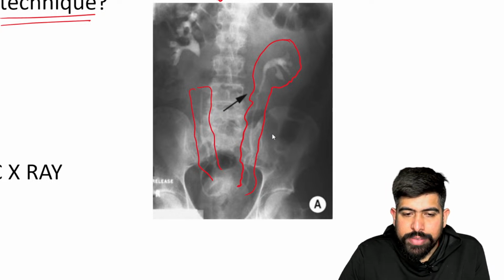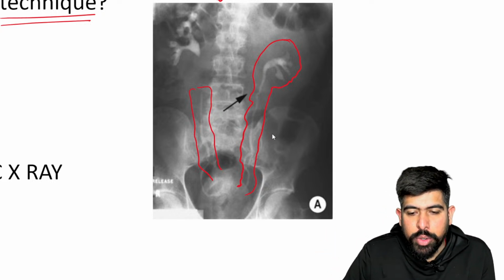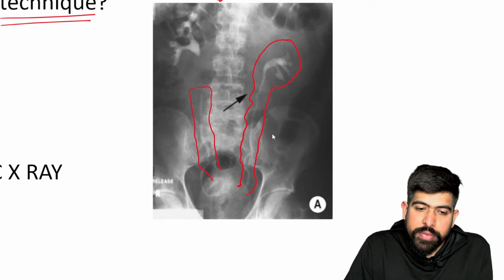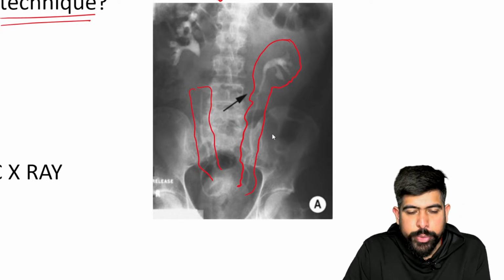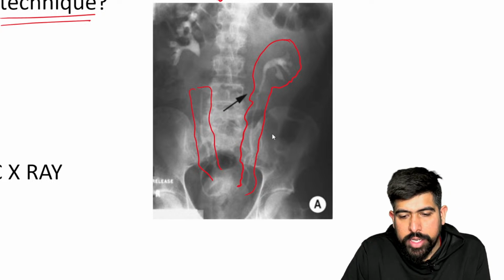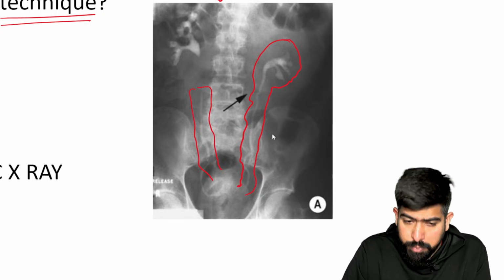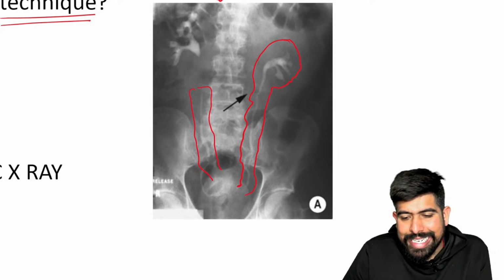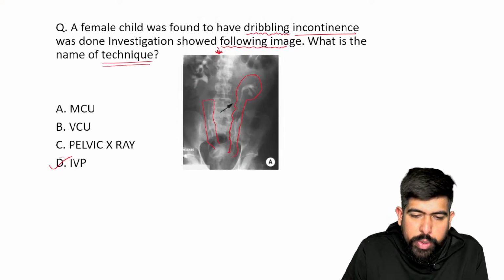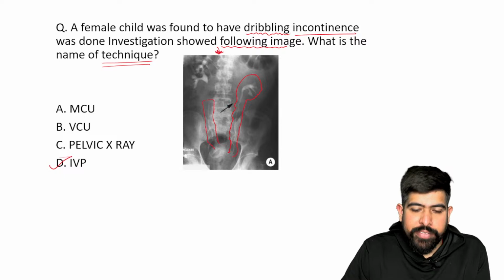For a duplex, it will be clearly seen that two ureters separately start from there, and then they join. But there are no two ureters. There is no duplex of the ureters, doctor. And yes, this is your staghorn calculus presented there. So we are doing this IVP for kidney and ureter related problems. For kidney disease and ureter disease, we do the intravenous pyelogram.